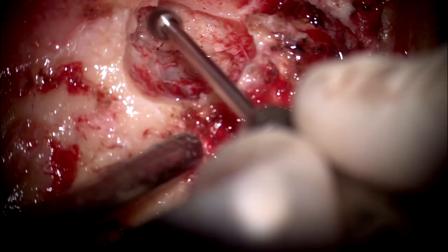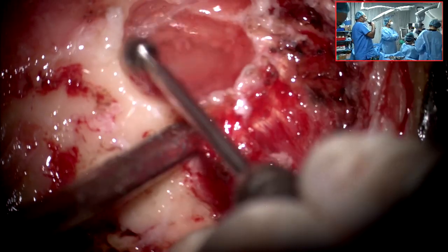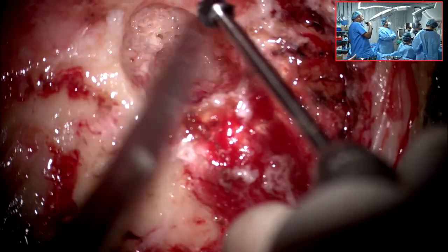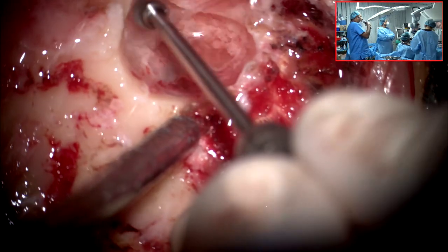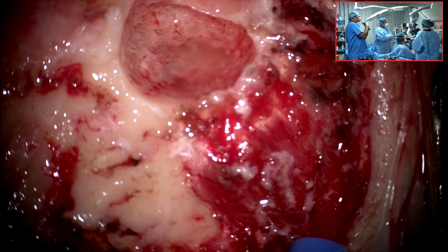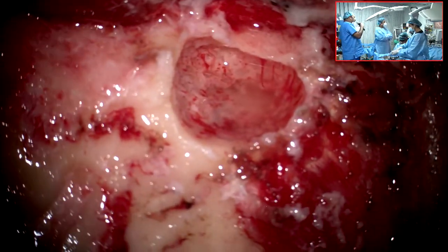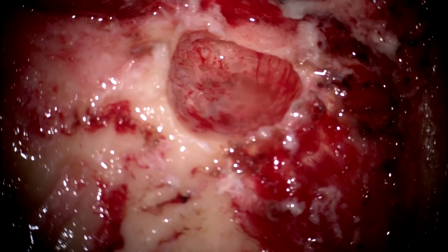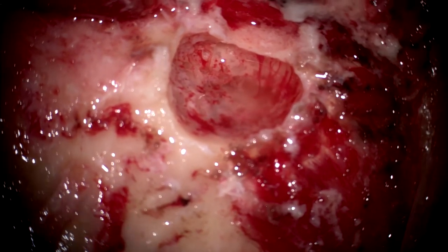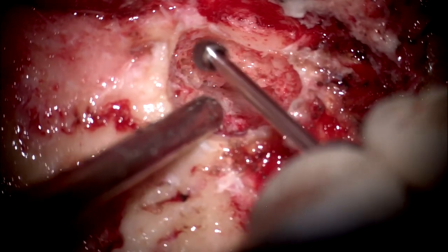So right now the cortical mastoidectomy has been started by Dr. Hajra. And see, he has raised the flap. Can you centralize, please? So he is doing a classical cortical mastoidectomy. See, anteriorly the flap is, the canal is not cut. The bony canal is kept intact.